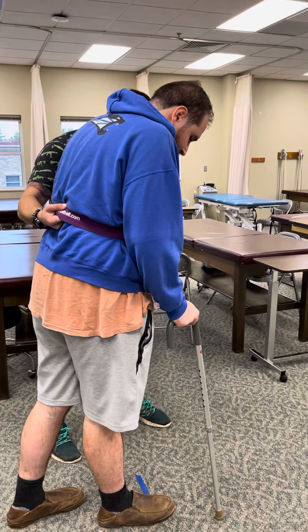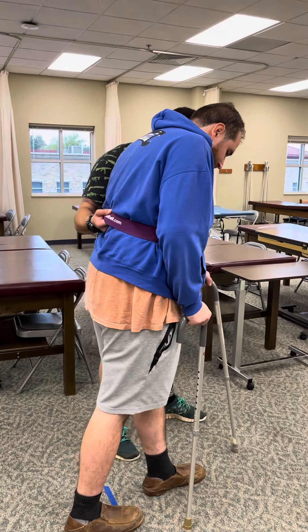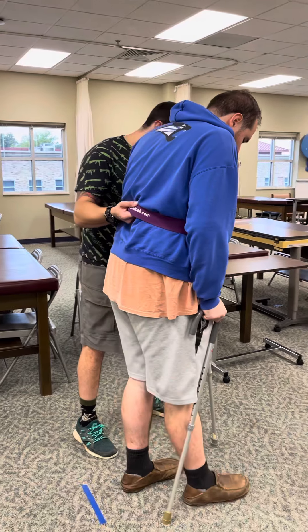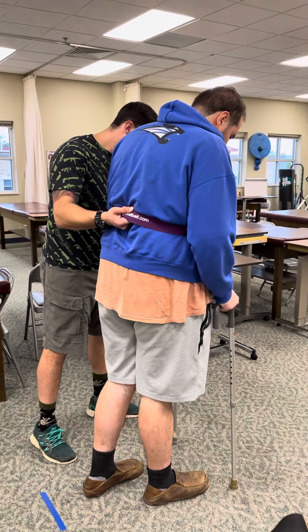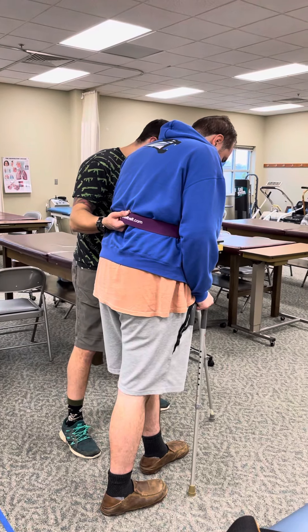Keep those canes wide. Left foot. Step to the device for me. Right foot. Right device, left foot. Left device, right foot.